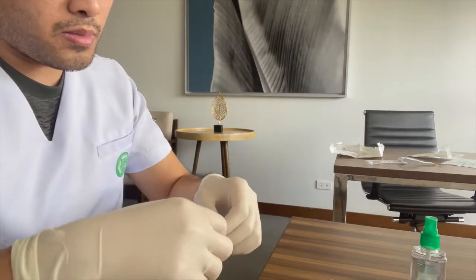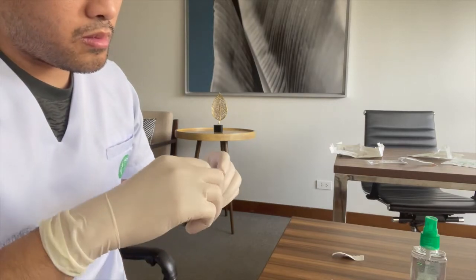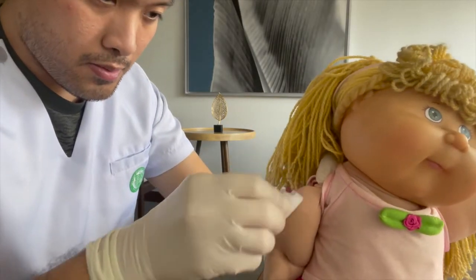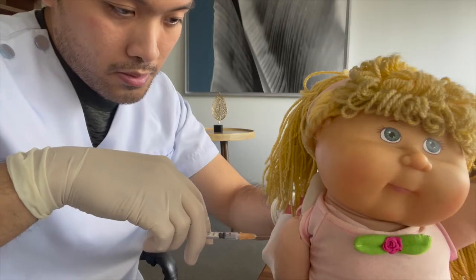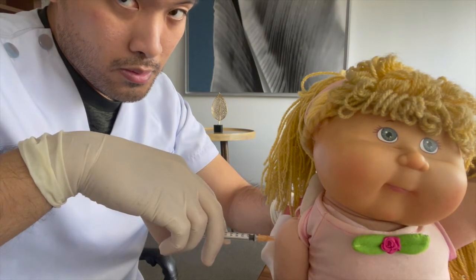So this is the alcohol swab. We apply it on the patient in a circular motion before we administer the vaccine. So we have the intramuscular first. We make sure that we approximate a 90-degree angle before we administer.